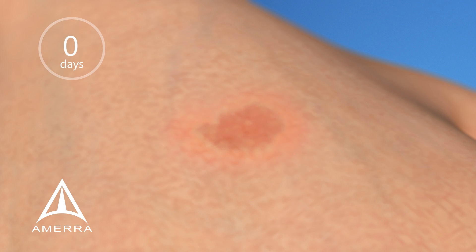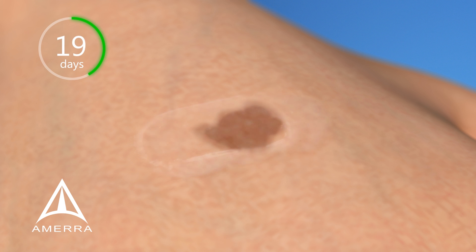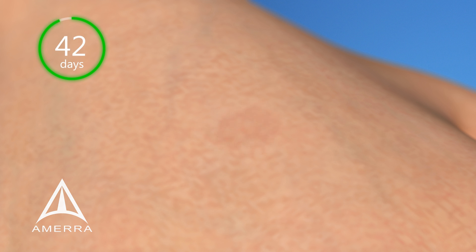Clients may experience some itching or tingling immediately after the CryoClear treatment. This will dissipate in a few minutes, and the client should not experience any downtime during the post-treatment phase. The client should apply a moisturizer followed by a mineral sunscreen during the next 14 days to the treatment site. The treatment site should remodel to normal pigmentation in 30 to 45 days after the initial treatment.